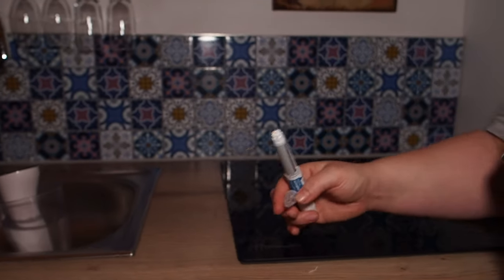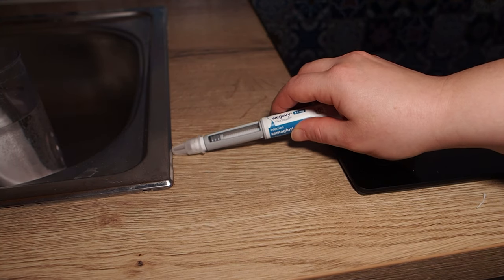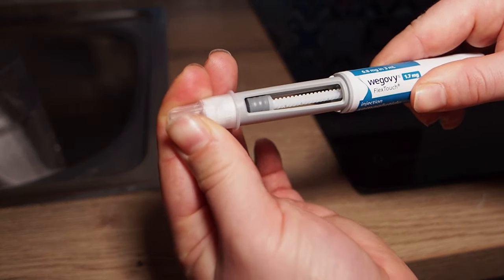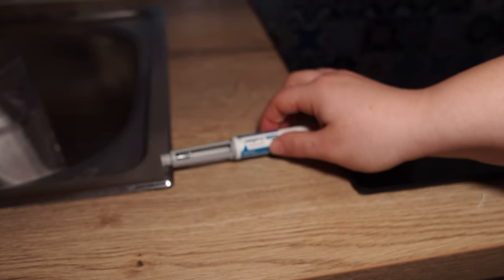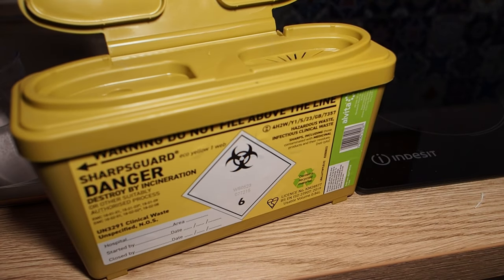Just put the lid back on. I personally just put it on directly, but the safety leaflet does say to put it on the side and push the pen into it so that you don't put the needle into your finger. You don't need to put both caps back on by the way, just the bigger one. Then screw it off. Make sure you do put the cap back on otherwise you could end up needle-sticking yourself, which isn't a disaster if it's your own needle but it's not ideal.